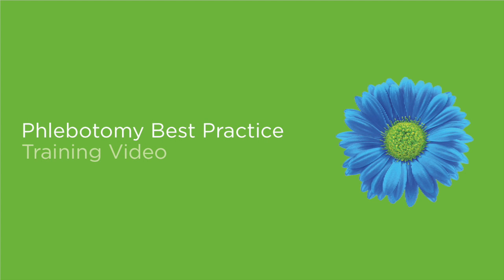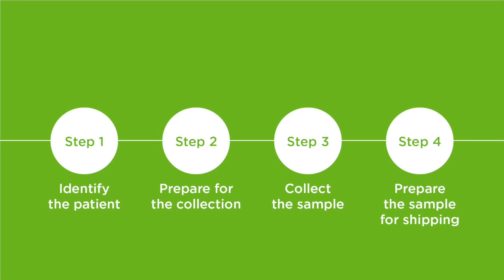Dynacare is committed to being Canada's health and wellness solutions leader. Thank you for choosing us to be your partners in care. In this video, we will share with you some phlebotomy best practices. Please follow along in your kit. By following these best practices, you can enhance patient care and reduce pre-analytical errors. We will demonstrate these best practices in four steps.